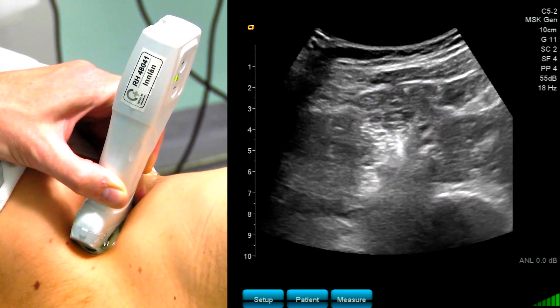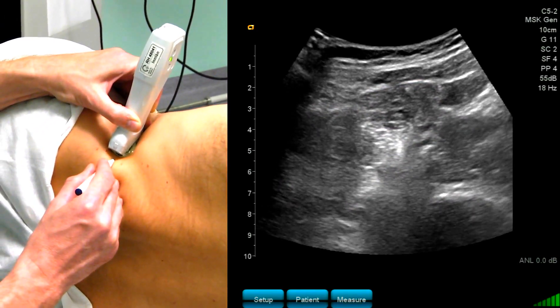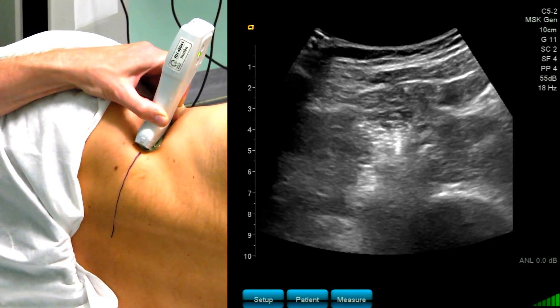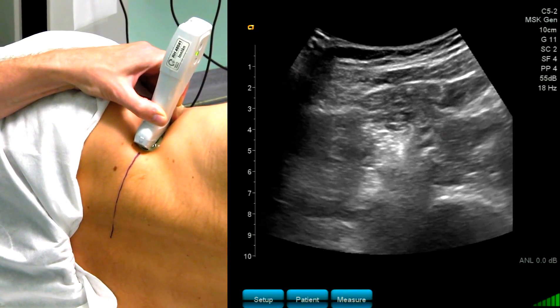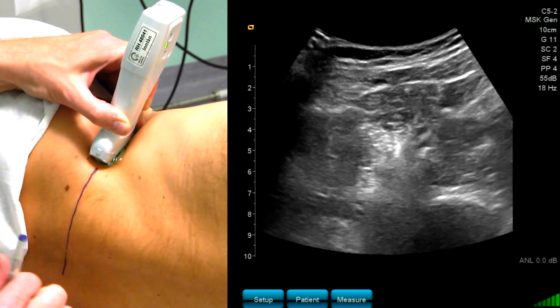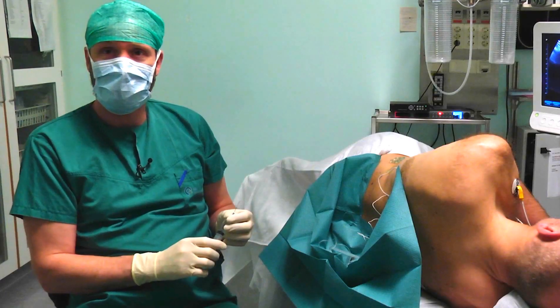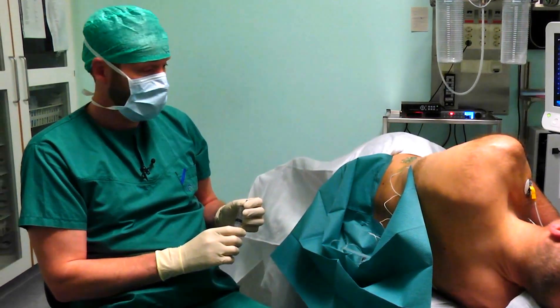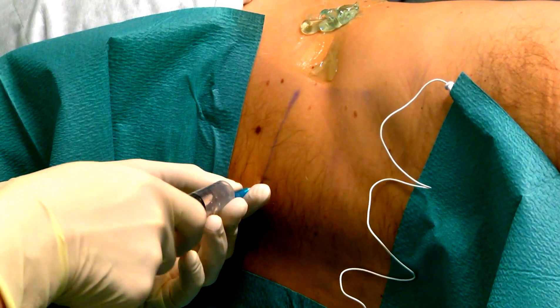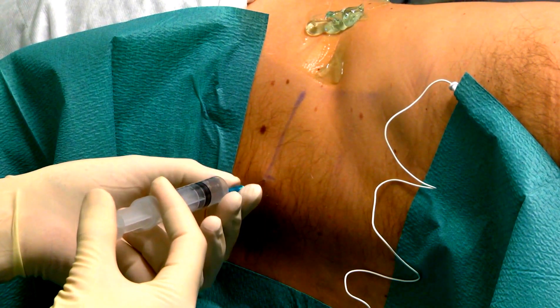Now the transverse process has disappeared and I will draw a line representing the intersection of the ultrasound beam and the skin of the patient. My point of needle insertion has to be on this line when I perform an in-plane needle approach, approximately three or four centimeters away from the midline. A sterile skin scrub was performed and now I do some local anesthetic injections at the point of needle insertion.